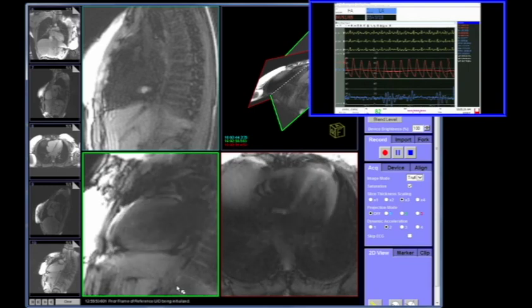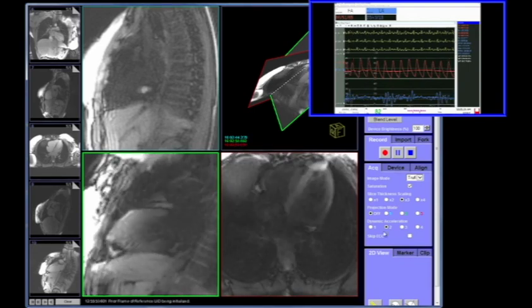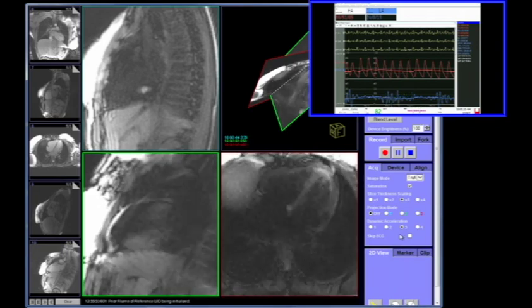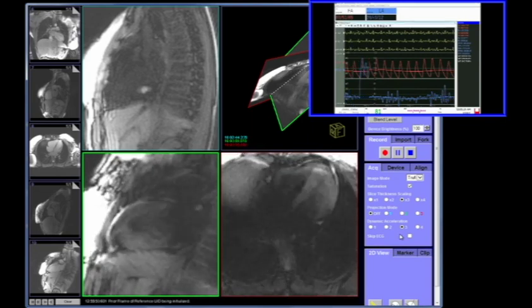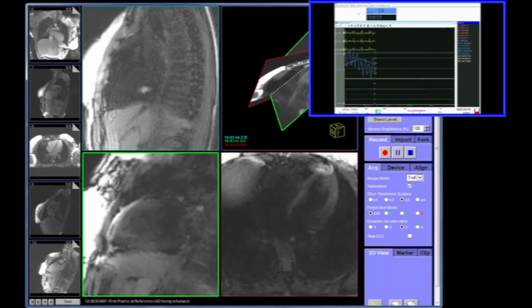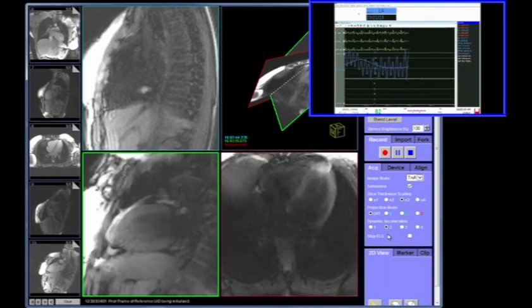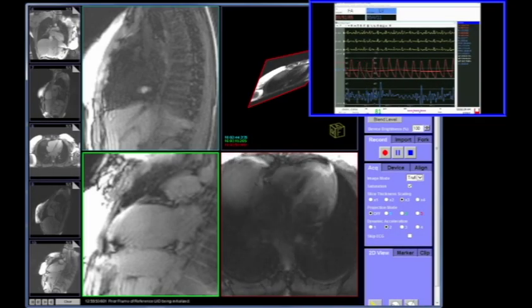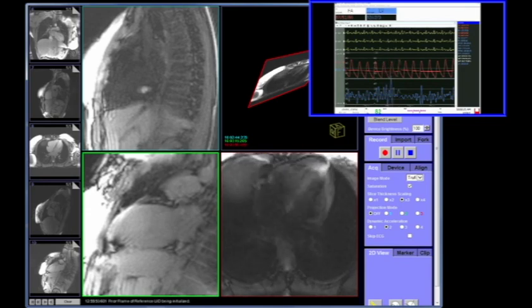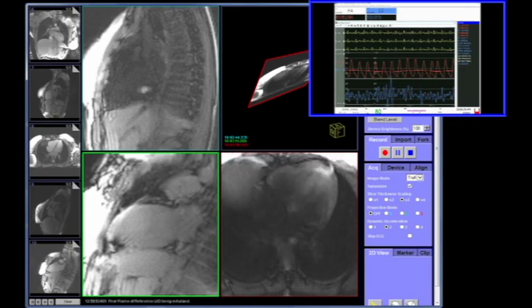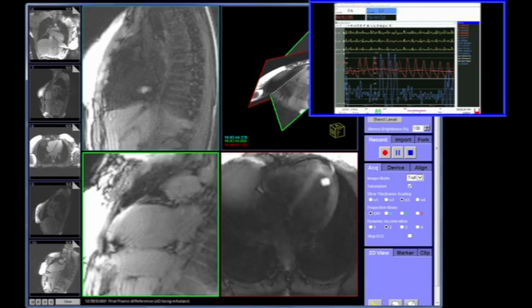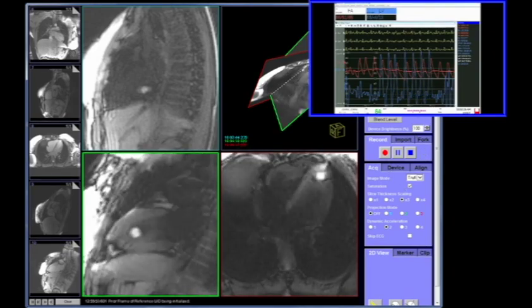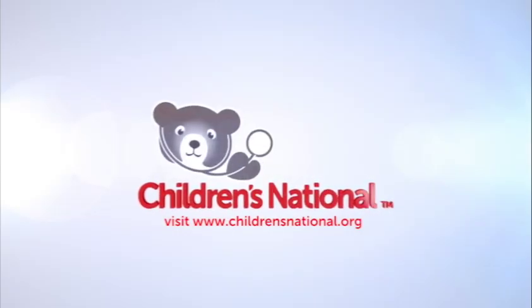While we're watching Josh cross from the right atrium to the left atrium — that web URL is icmr.nhlbi.nih.gov. There we go — that's the left atrium. You can see the balloon there on the four-chamber view, right by the left pulmonary vein. Scan off. Let's take left atrial pressure. There you see crossing from the left atrium to the left ventricle. Look at the hemodynamic tracing.